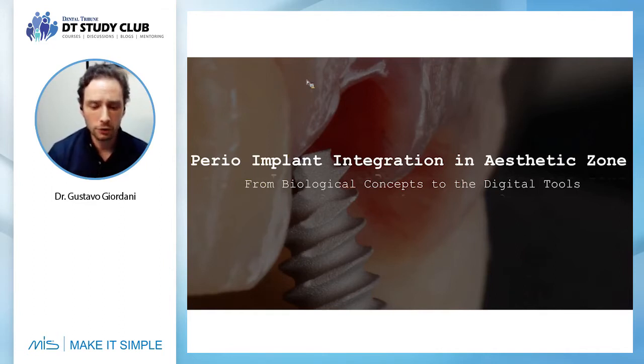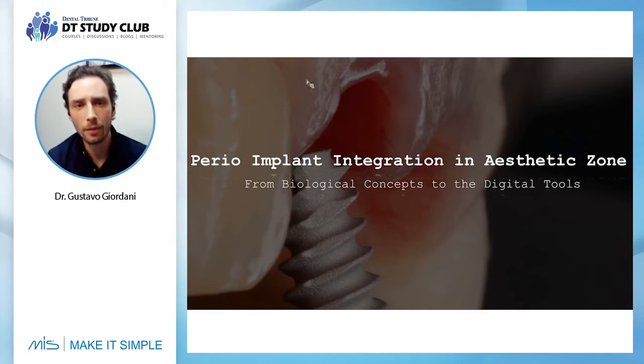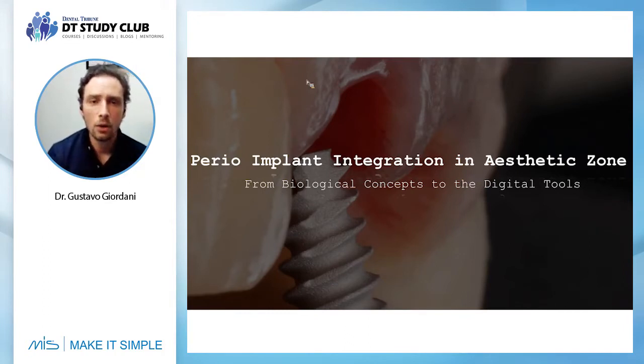So we are trying now as much as we can to copy nature by using the natural format and the natural root of the patient to create the perfect emergence profile, to create a minimally invasive approach, and to create a protocol so we can touch the patient less, and unscrew less and less. With this, we are achieving very good results in the aesthetic zone.